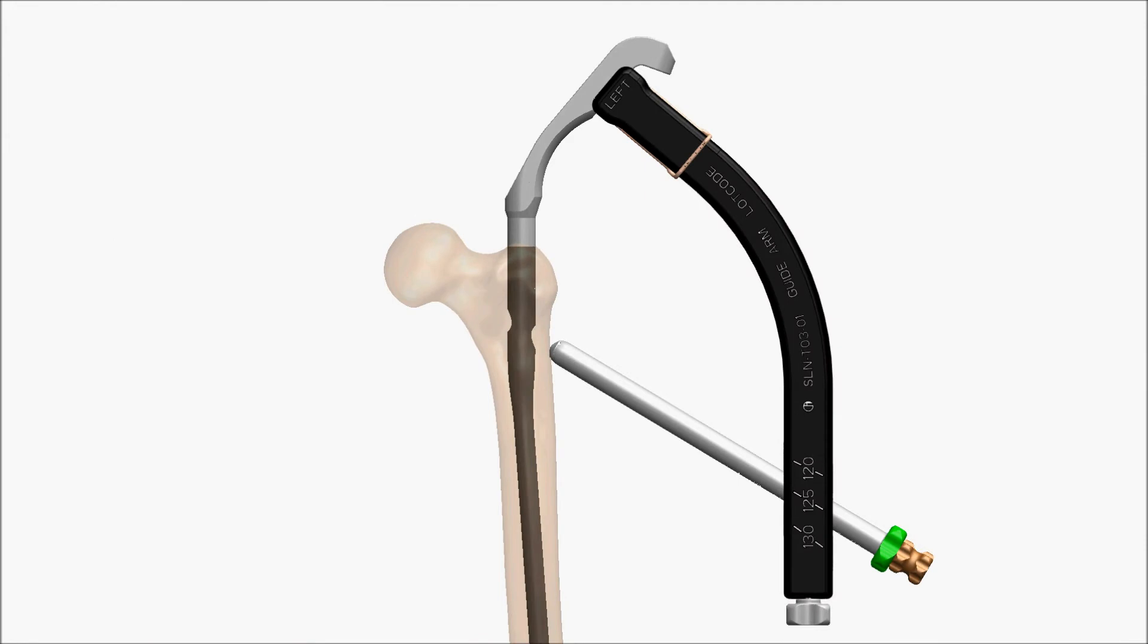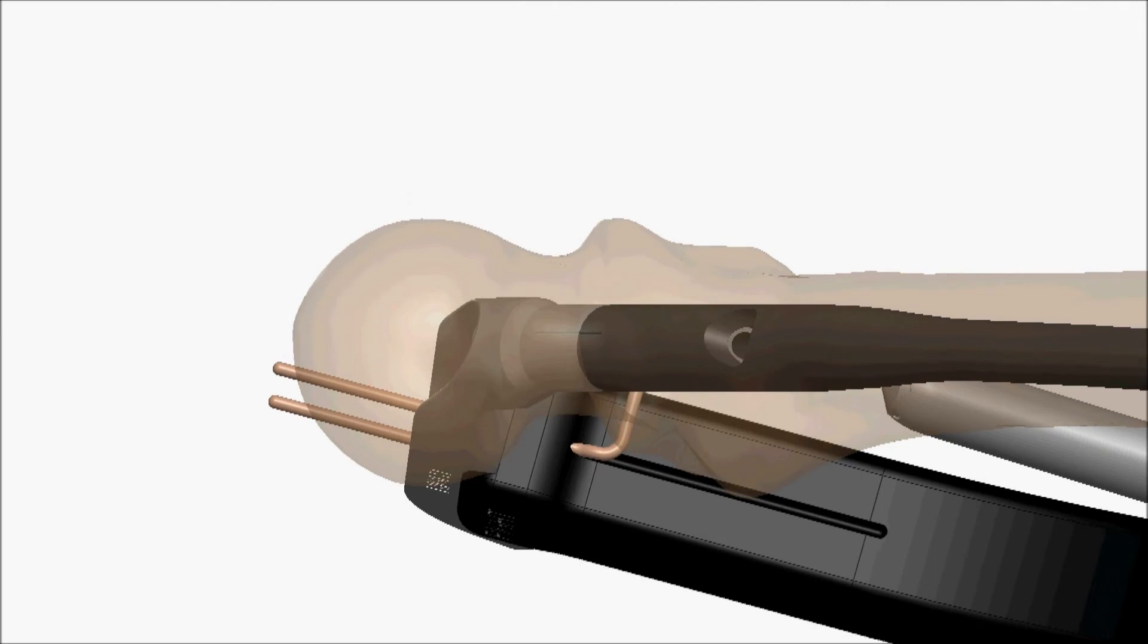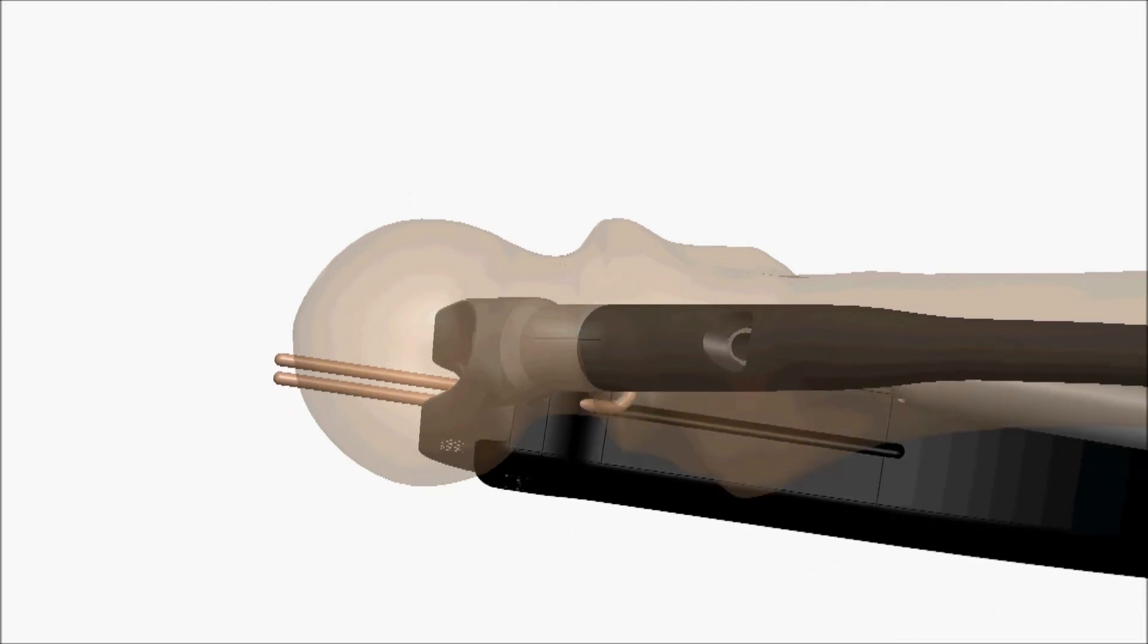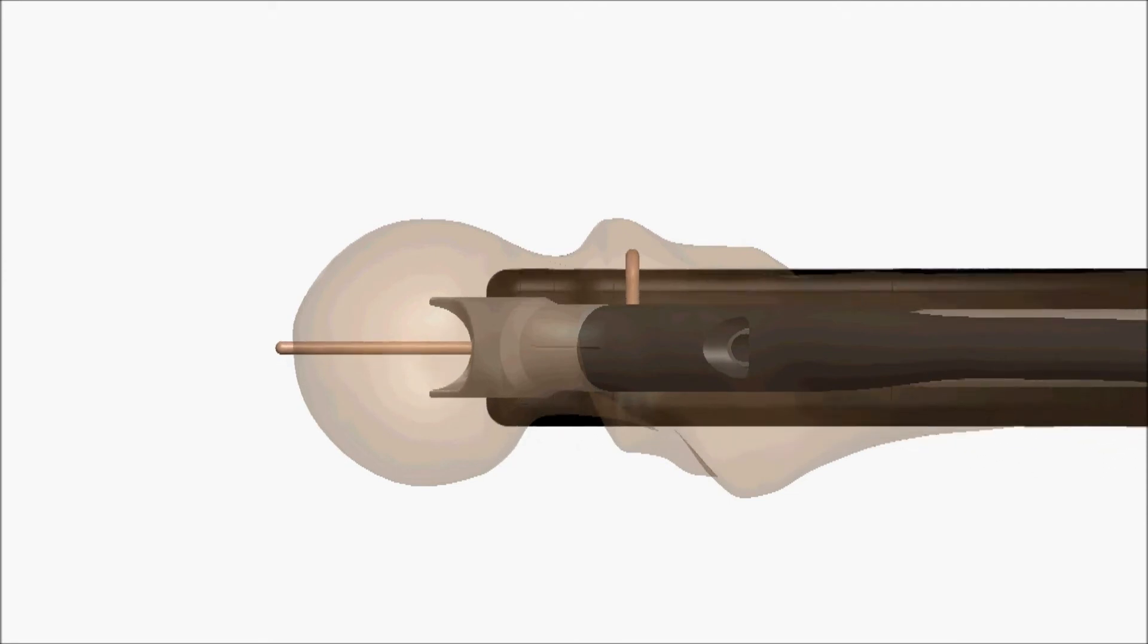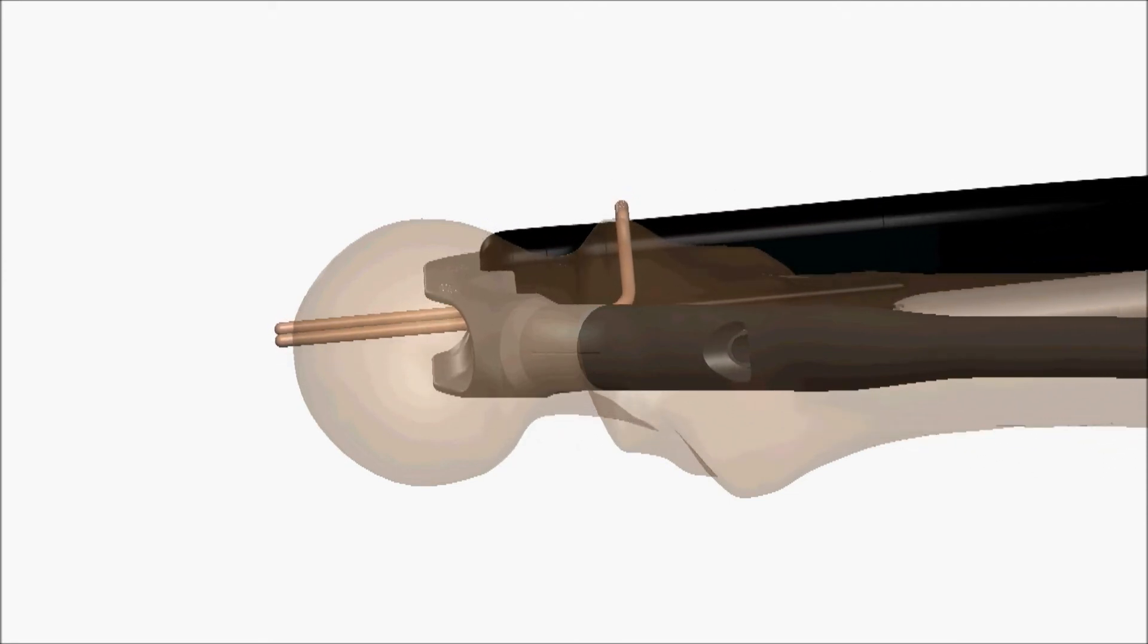Raise the goal posts and position the C-arm for a lateral view of the proximal femur. Once a good lateral of the proximal femur is obtained, rotate the guide arm until the two prongs of the goal posts overlap and are seen as one.